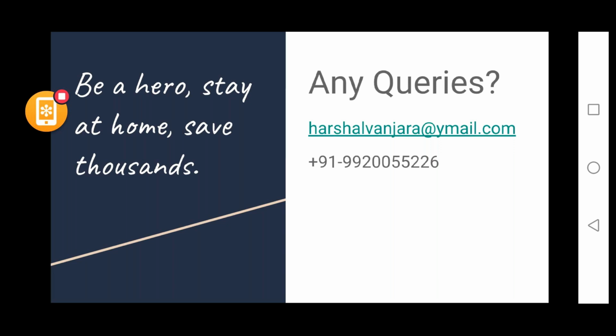Yes, sir. We had already a question, but after restarting it disappeared. I guess there is one question I'm going to read out for you. Is there any relation between corneal topography and aberrometry?